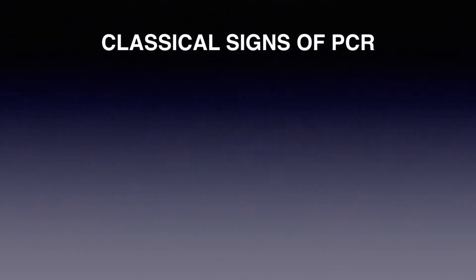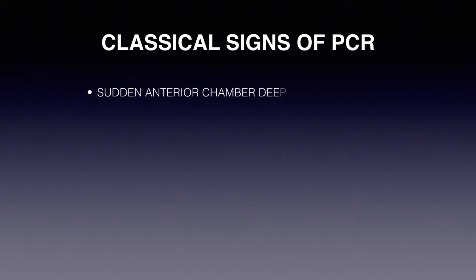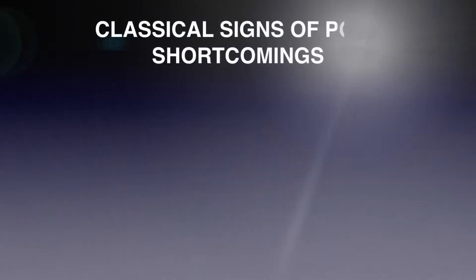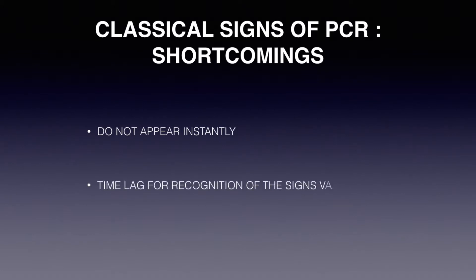The classical signs of posterior capsule rupture are sudden anterior chamber deepening, pupil snap sign, sudden increased fundal glow, reduced followability, nucleus tilt, and nucleus drop. The shortcomings of these signs are that they do not appear instantly, and the time lag for recognition varies according to the expertise of the surgeon.